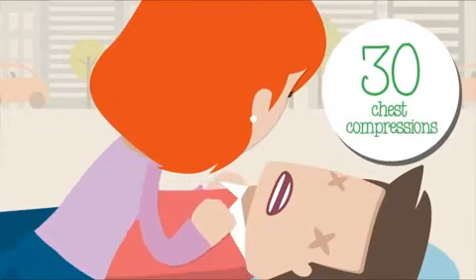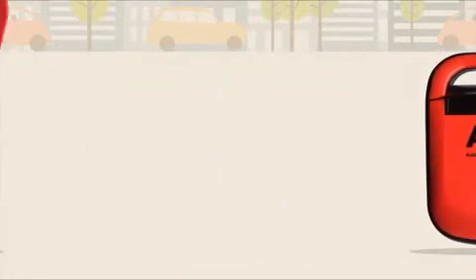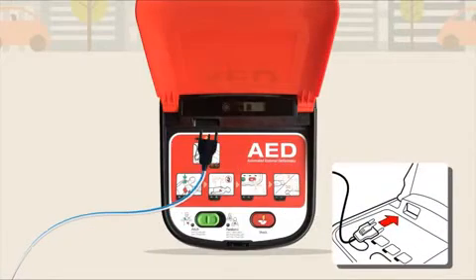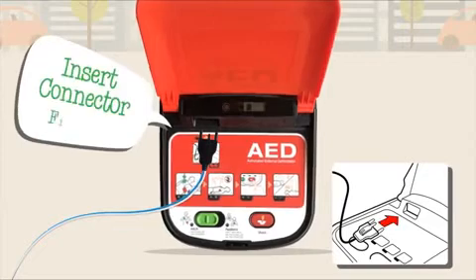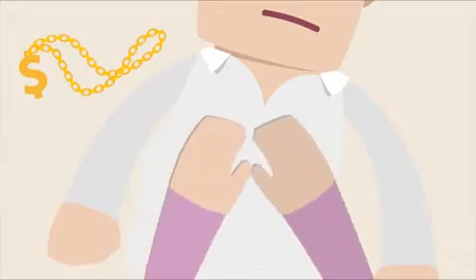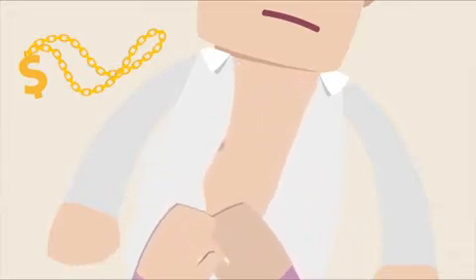Open the lid of the Mediana AED — this will turn the power on. The electrode pads are pre-connected, but if for some reason they're not, the machine will tell you to insert the connector and firmly plug in the pads. Once this is done correctly, the machine will tell you to remove clothes from the patient's chest.